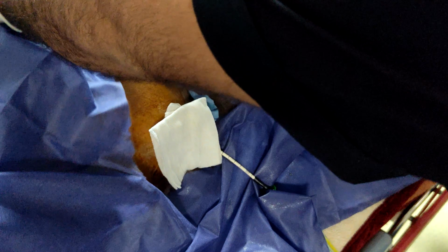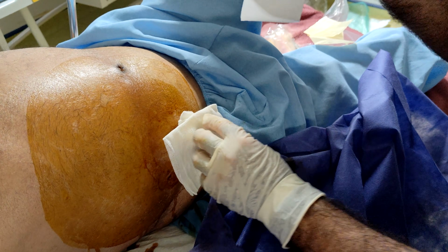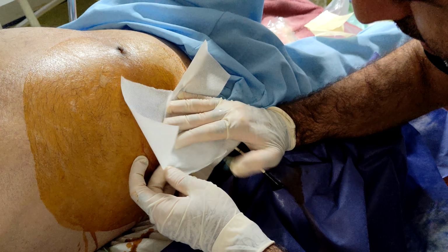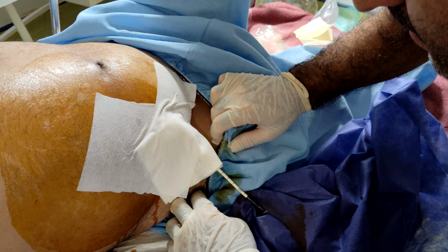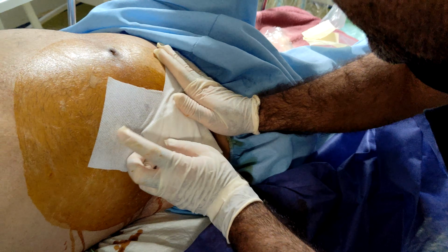Then the catheter is secured to the skin by using sutures or fixation devices. After the procedure, we cover the catheter site with a sterile dressing and inspect it for leakage or bleeding.